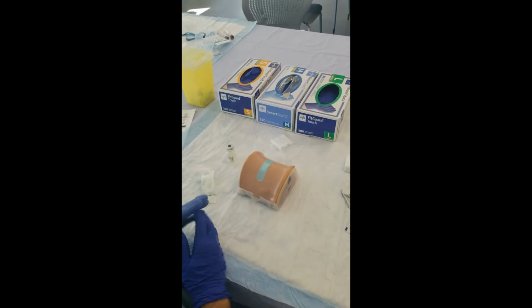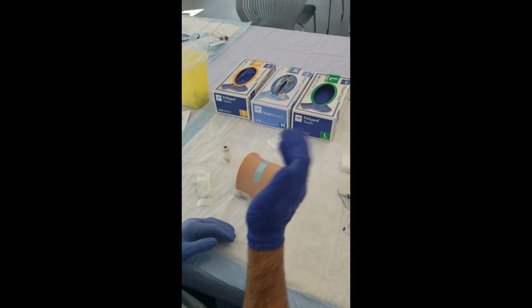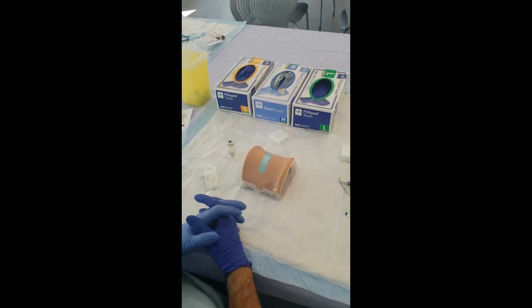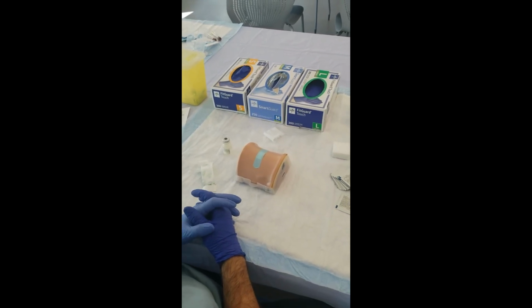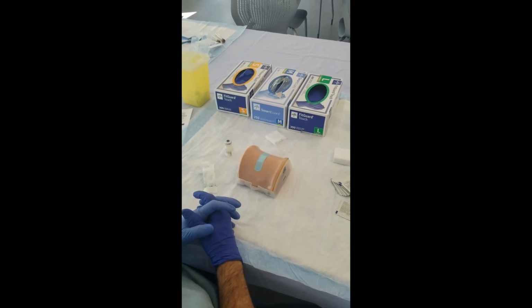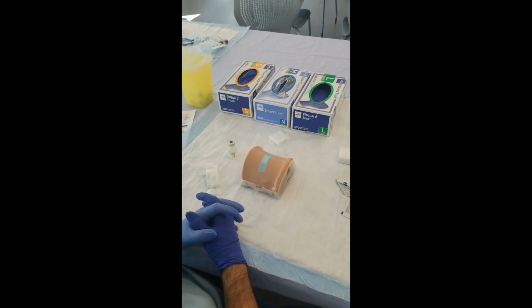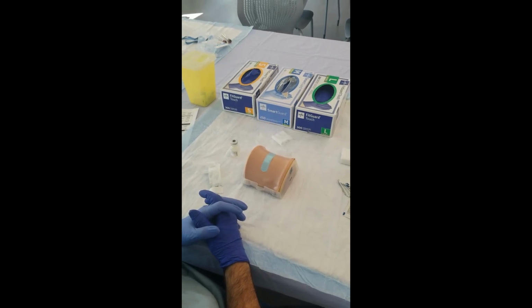Step 44. Student stated, I would give the patient instructions to check for signs and symptoms of infection. Step 45, student stated, I would now document in the patient's chart the date, the time, the needle gauge, the location of the injection, any complications, and any follow-up instructions given.